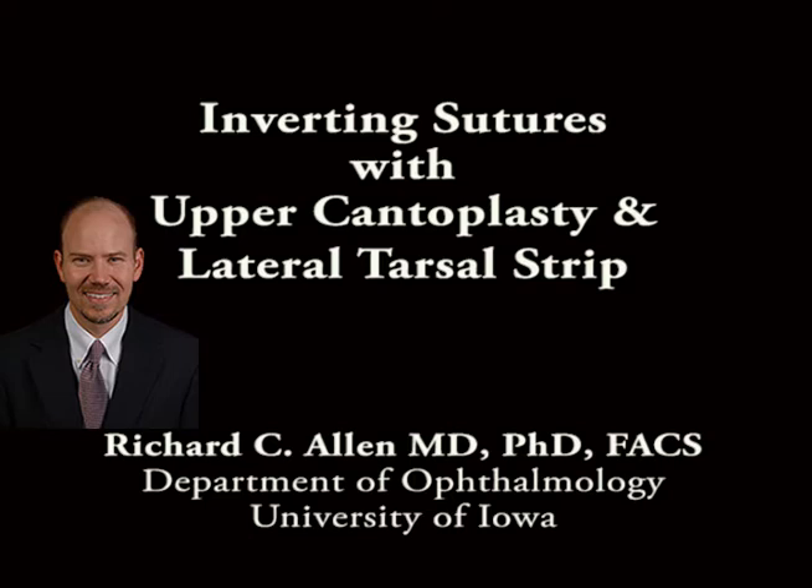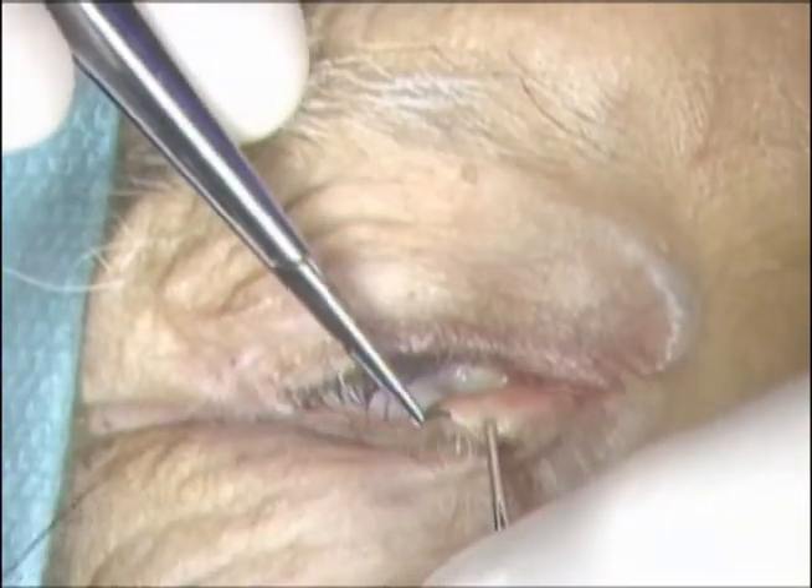This is Richard Allen at the University of Iowa. This video demonstrates repair of involutional lower lid ectropion using inverted sutures with a lateral tarsal strip and upper canthoplasty.